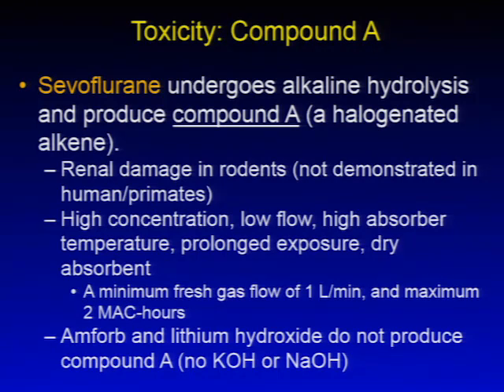Amsorb, by the way, and also lithium hydroxide, do not produce compound A because there's no KOH or NaOH contained in those absorbents.